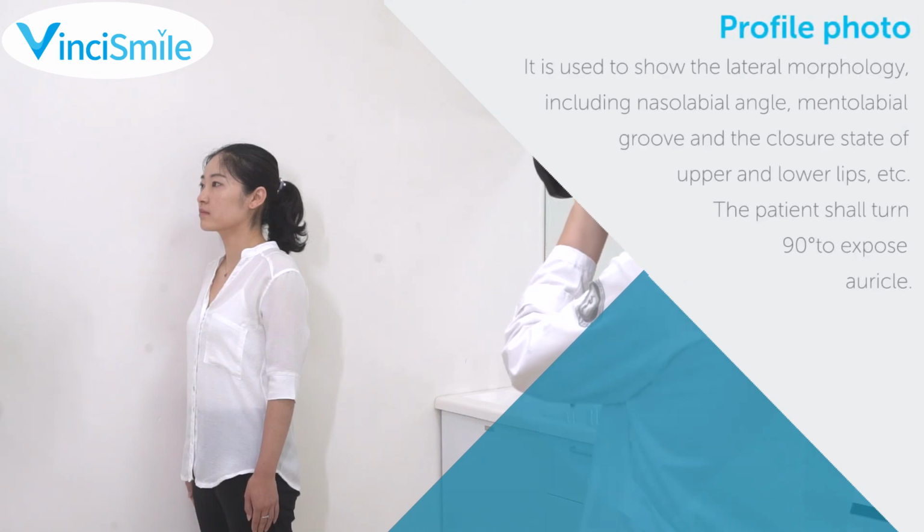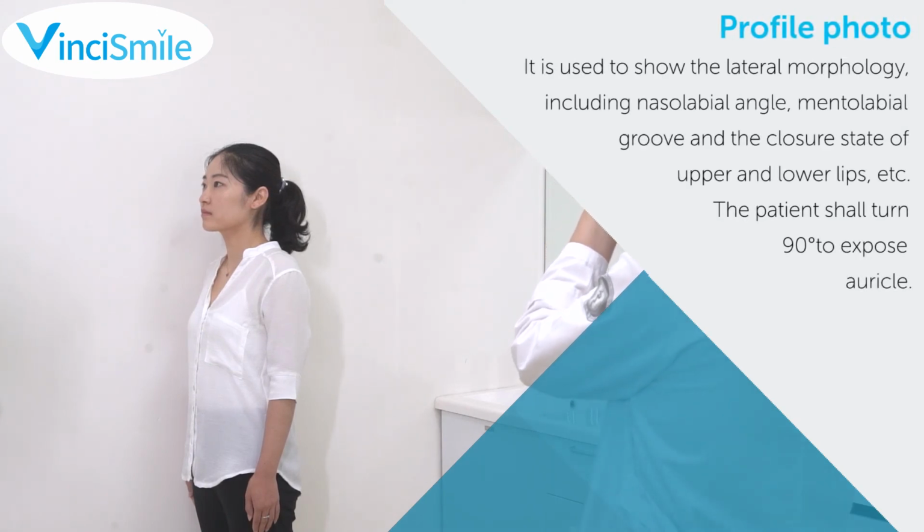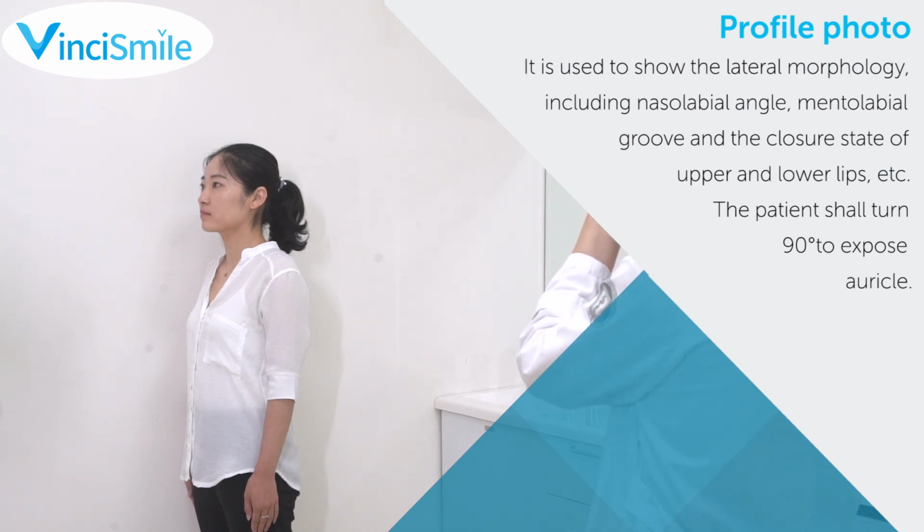Profile photo. It is used to show the lateral morphology, including nasolabial angle, mentolabial groove, and the closure state of upper and lower lips, etc. The patient shall turn 90 degrees to expose auricle.